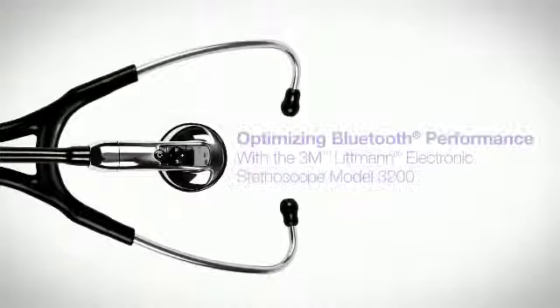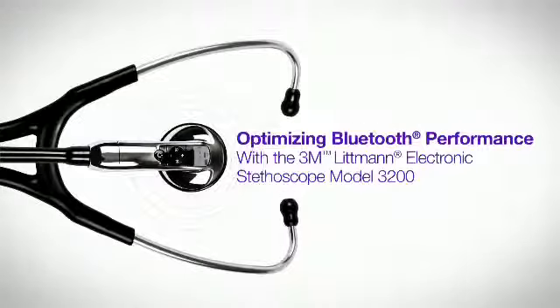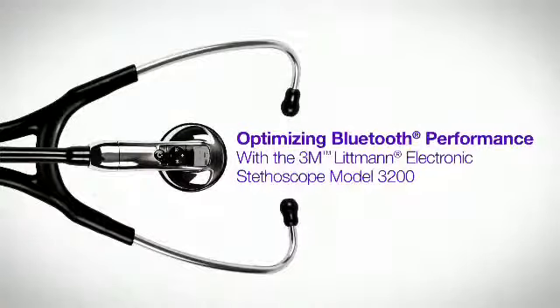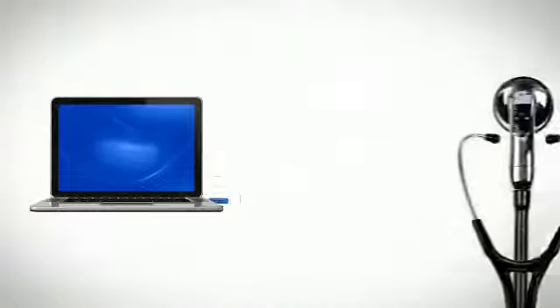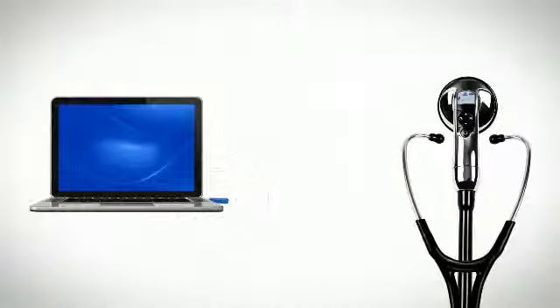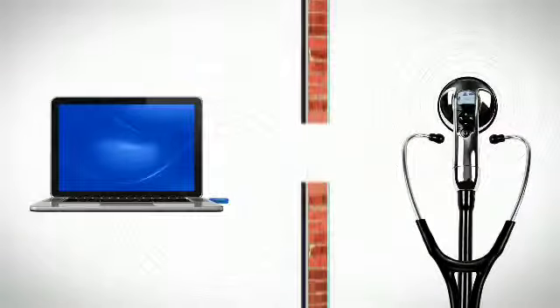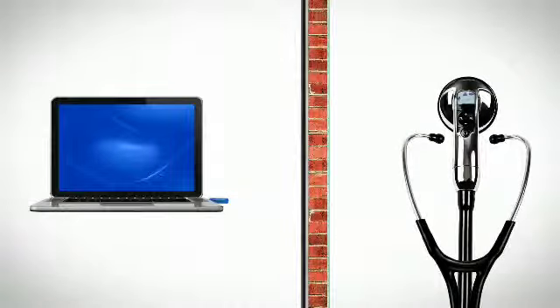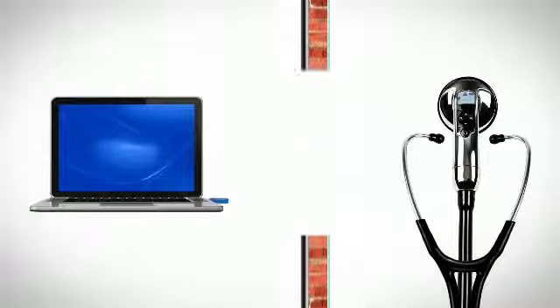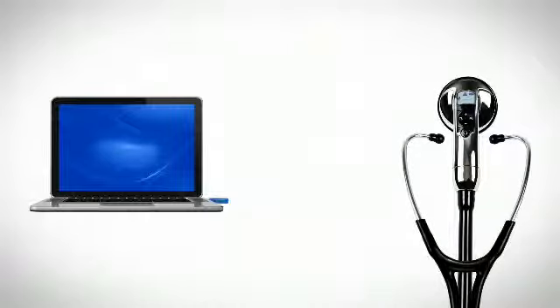This video will help you get the most out of the Bluetooth technology that comes with your Litman Model 3200 stethoscope. To achieve a reliable Bluetooth wireless connection, make sure that the path between the stethoscope and USB Bluetooth adapter is free of physical obstructions.